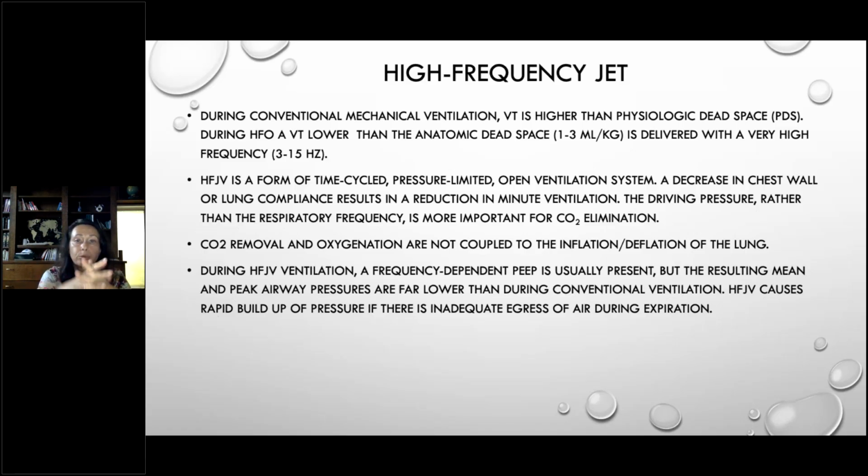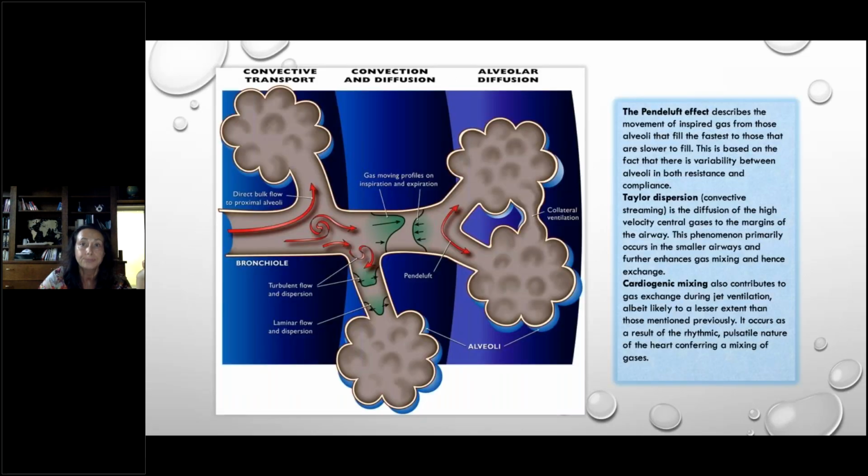Frequency-dependent PEEP is also present during the jet ventilation. But even though the PEEP is present, the mean airway pressures and peak airway pressures are much lower than during conventional ventilation. But unfortunately, I already mentioned that this has to be an open ventilation system. If the outflow, the egress of air, is closed, if there's some kind of obstruction, then the peak pressures can build drastically and cause a pneumothorax.